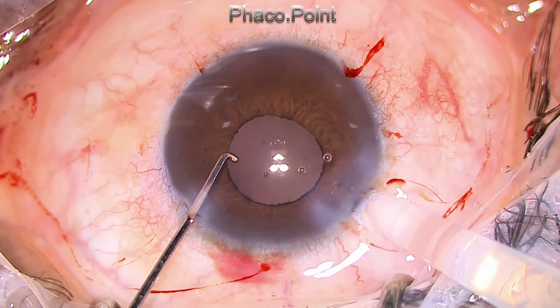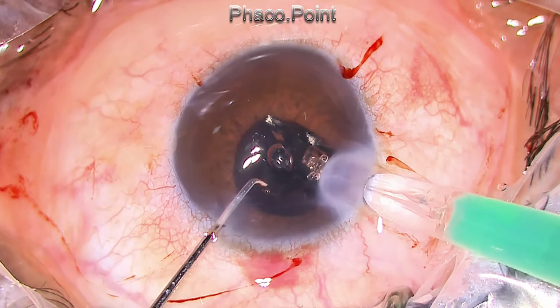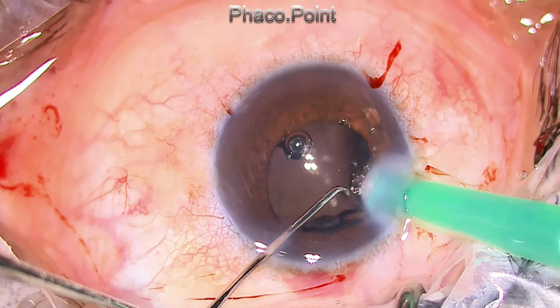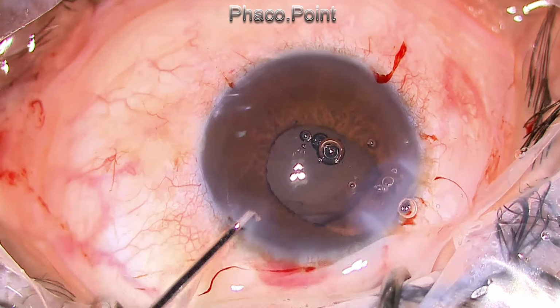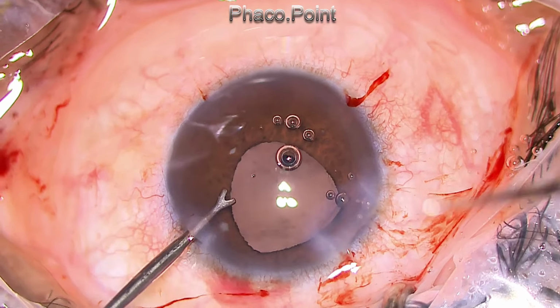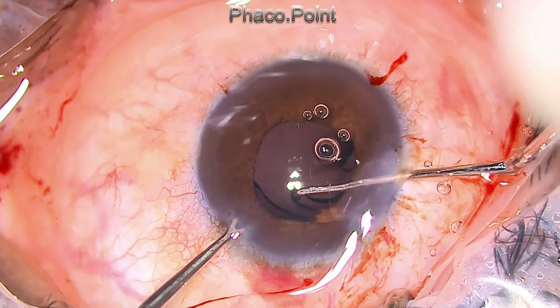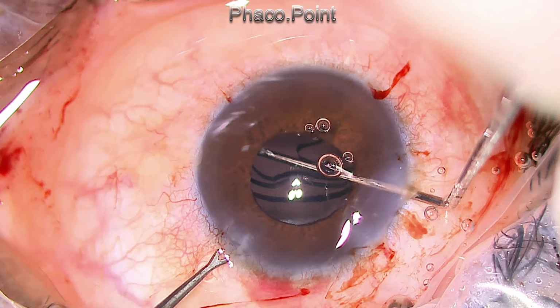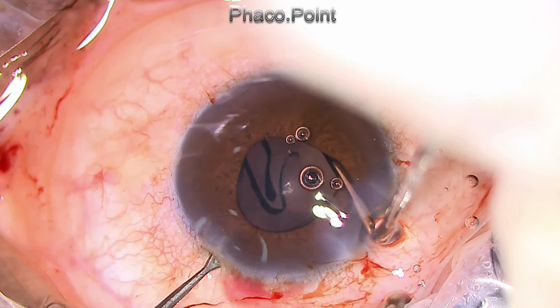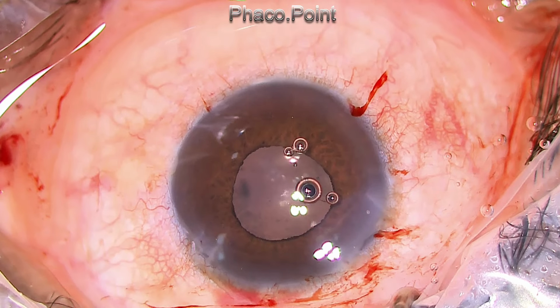The intraocular lens has to go into the capsular bag, so as I inject the lens, the leading haptic is pushed into the bag, and this leaves only the trailing haptic to be flexed and tucked inside the capsular rhexis edge to go inside the capsular bag. I flex the trailing haptic slightly, push it posteriorly, and with a gentle amount of rotation I got the entire lens into the capsular bag. The patient went on to do very well.